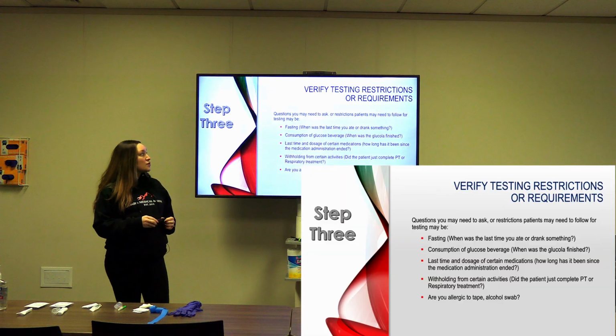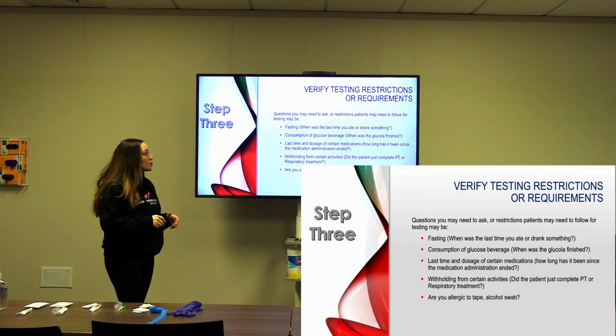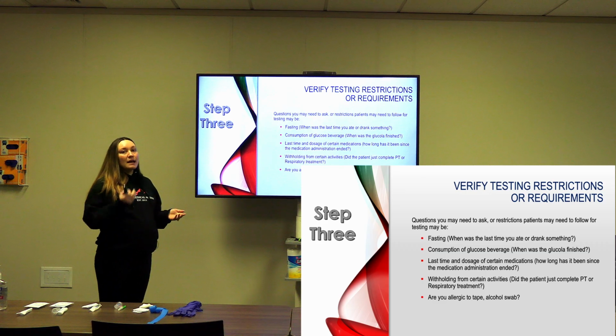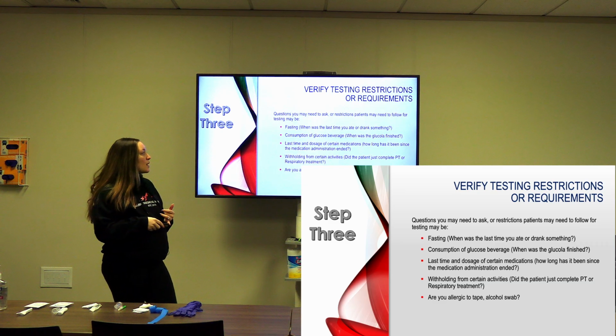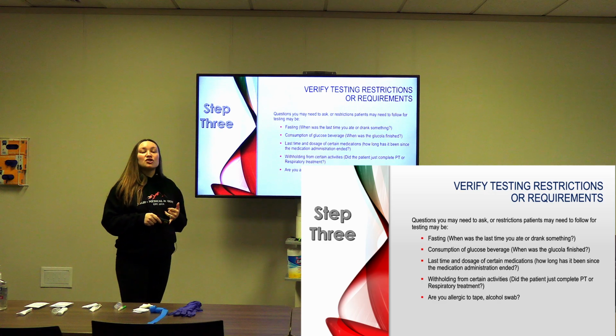Verify your testing restrictions and requirements. Questions you might need to ask or restrictions patients may need to follow for testing may be fasting. When was the last time you ate or drank anything? Consumption of a glucose beverage for glucose testing. When was the glucola finished? Last time and dosage of certain medications. How long has it been since the medication administration ended?